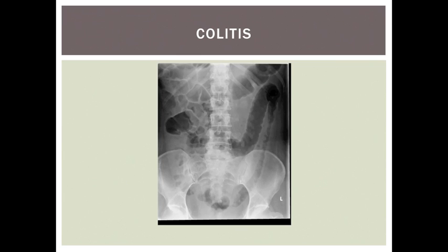The changes seen in colitis are the same for both infective and inflammatory causes of colitis. In this x-ray you can see thickening of the left colon. You can see a thick white line running along the side of the bowel lumen, and this is oedema in the colonic wall. You can see that this continues into the transverse colon, which has dipped down into the middle of the abdomen.